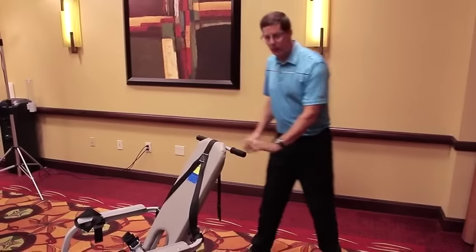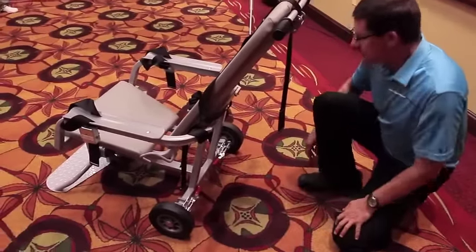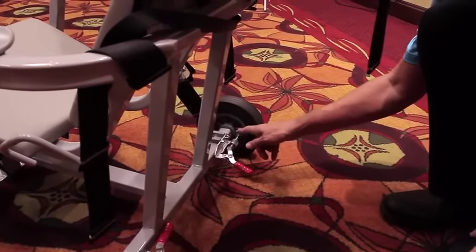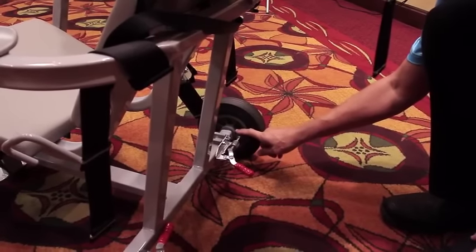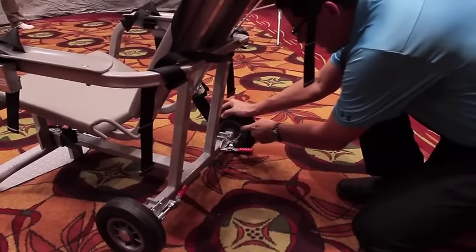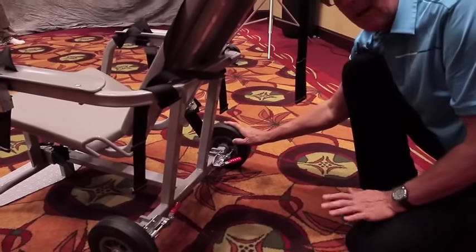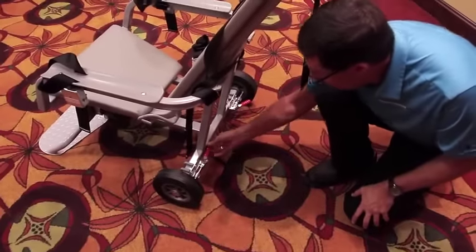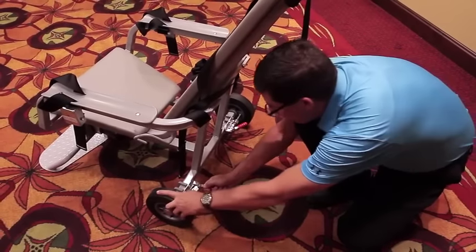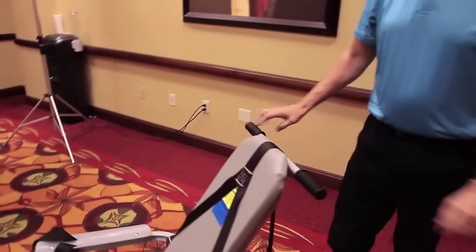Once you've placed the chair in the proper space, you need to set the brakes. To set the brakes, go to the back of the chair and you'll see two red levers. Take the red lever and move it towards the tire — the top of the piston head is custom made to fit directly inside the slots in the hub of the tire. It may be necessary sometimes to rotate that tire somewhat to push that piston head directly into the slots, and then once you get that there, push the lever the rest of the way towards the tire and that brake is secured. Repeat the process for the other side: move the red handle towards the tire, making sure that the piston head fits inside the hub, and then push the lever the rest of the way towards the tire until it's locked out. Now both brakes are secure and the chair cannot be moved.